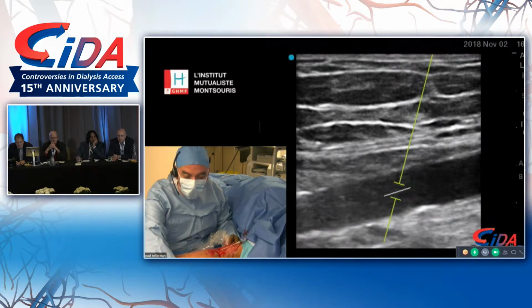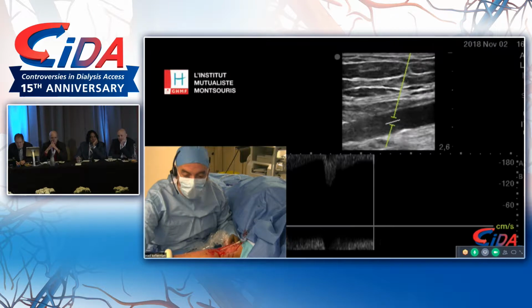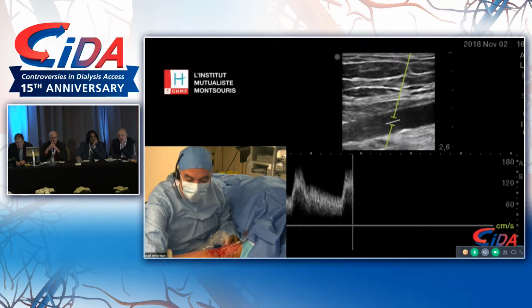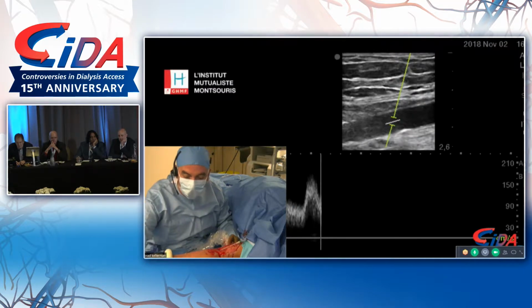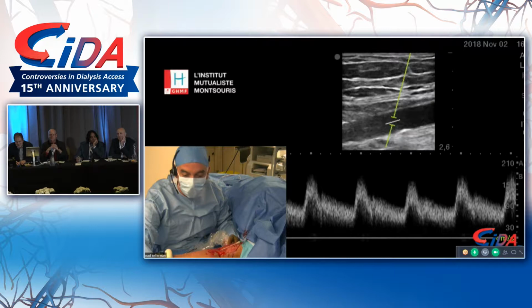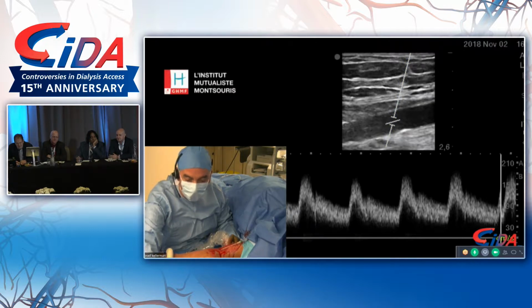So what we do here for all our cases, we give an axillary block, and we also give some sedation, especially when you do a live case. You don't want to have the patient start singing, but generally we try to give them some sedation, and they all get axillary block. To be honest, the axillary block is more for the vasodilation and less for the actual pain, because for the pain, you can easily do it with local anesthesia, no doubt about it.